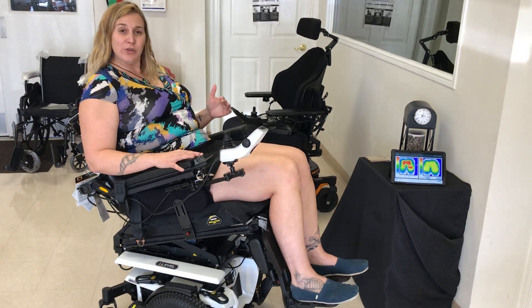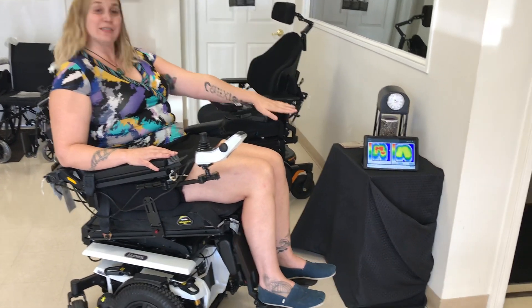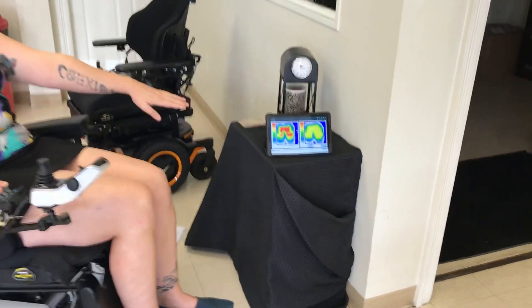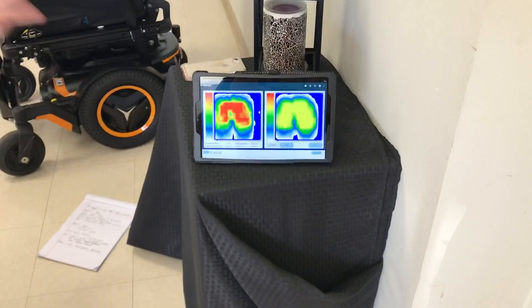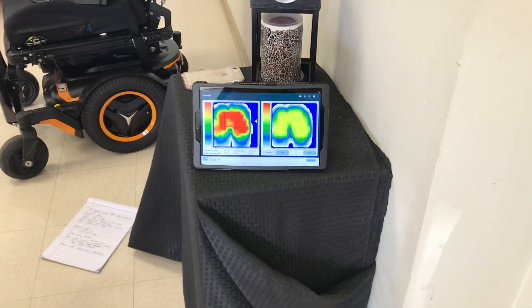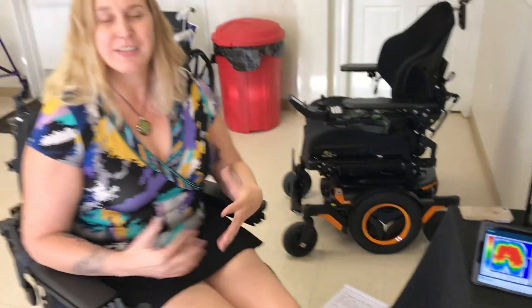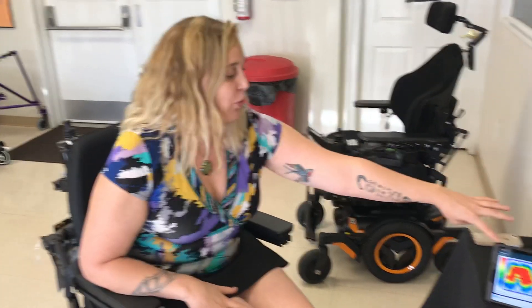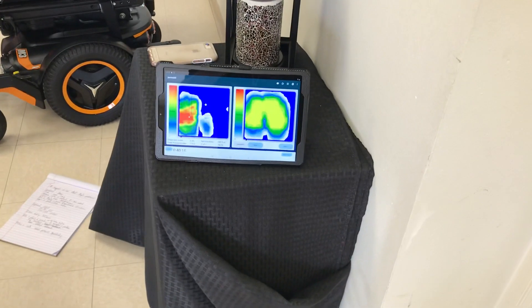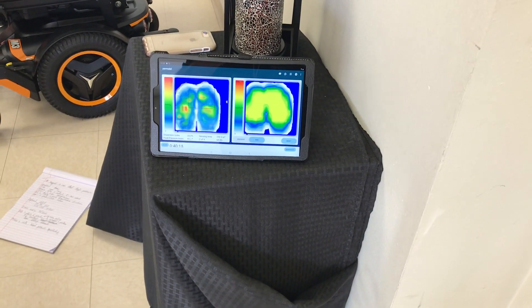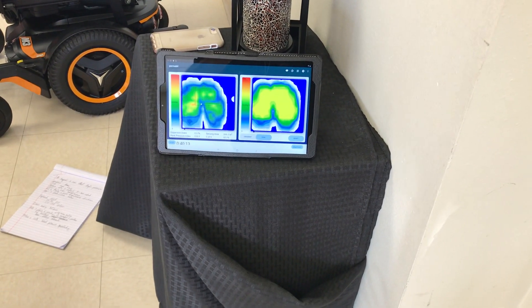What we're going to do today is look at some pressure mapping. This is a tool that can be used to see what's going on with someone's specific bony prominences and the way that they sit. It's also a way that we can analyze which cushion might be the best for dispersing that pressure. Over here, you can see that if I shift my weight, I can completely offload — so that would be good, and I would not need these features.